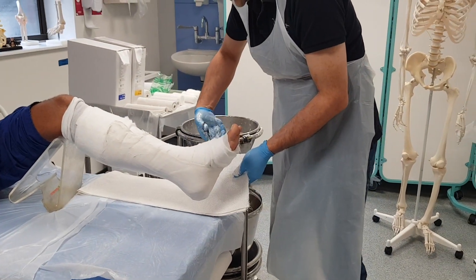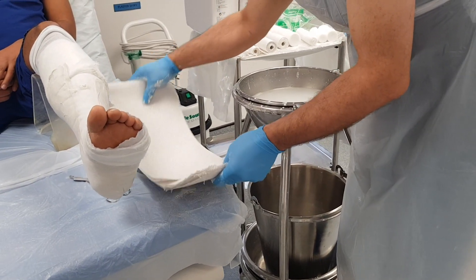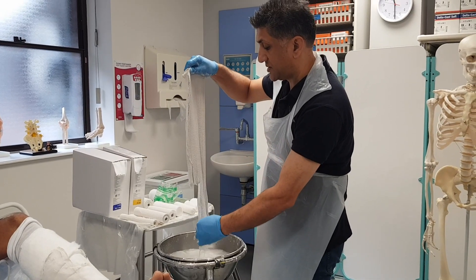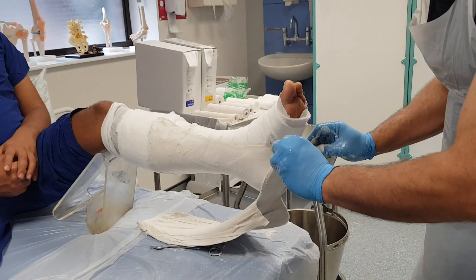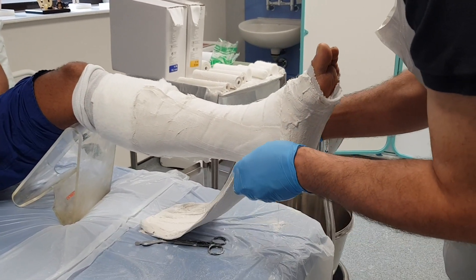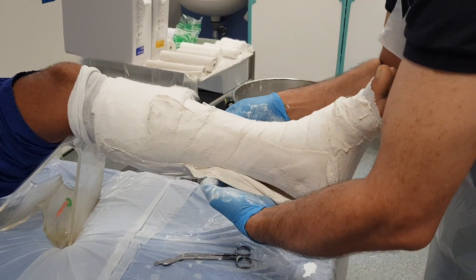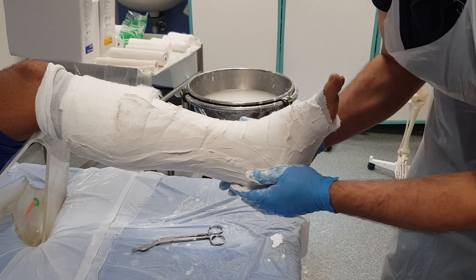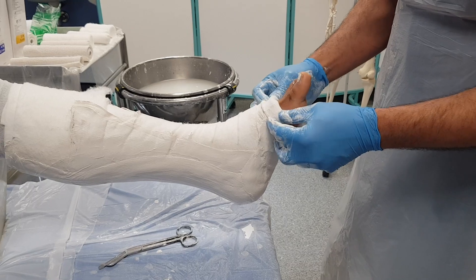Now I'm going to apply my main slab. I'm going to make some incisions at the sides to allow it to fold at the level of the ankle. I'm going to dip this in the water, take out the bubbles, and squeeze out the excess fluid. I'm applying this starting with the metatarsal heads because that's the difficult place, and hopefully my stirrup is going to allow this to stick down so it doesn't fall off. I'm using my palms to smooth this on and join it onto the stirrup.